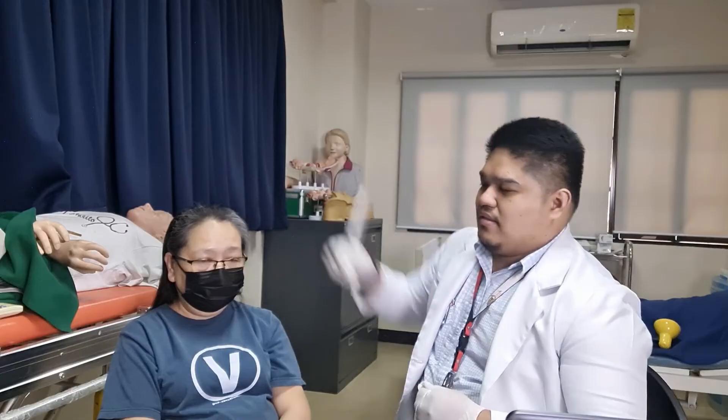The patient was able to hear the vibration of the tuning fork equally in both the left and right ears. I will now perform the Rinne test.